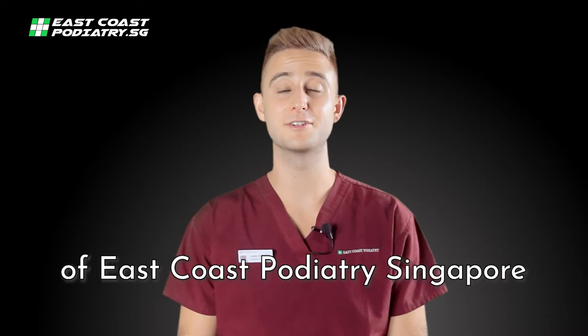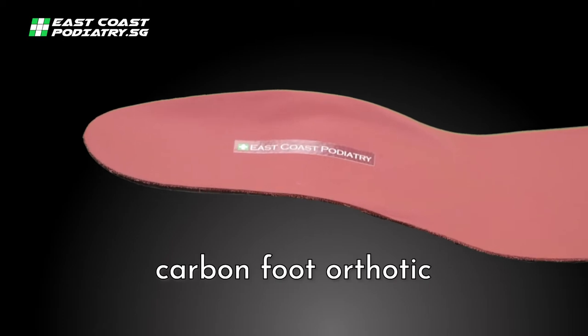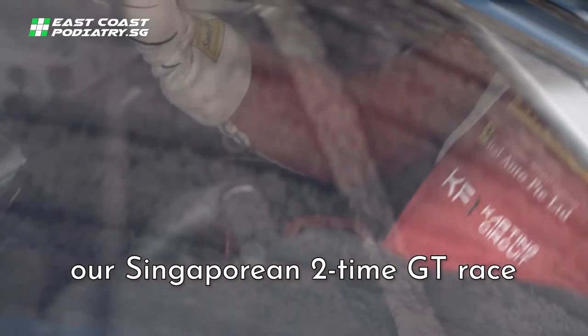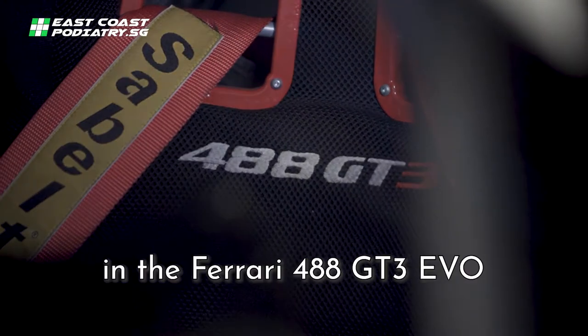Hi, I'm Louis Nerny of East Coast Podiatry Singapore. What we have here is a set of race-specific carbon foot orthotics that we have designed for our Singaporean two-times GT race champion Sean Hudspeth in the Ferrari 488 GT3 EVO.